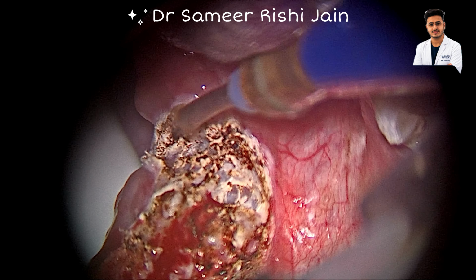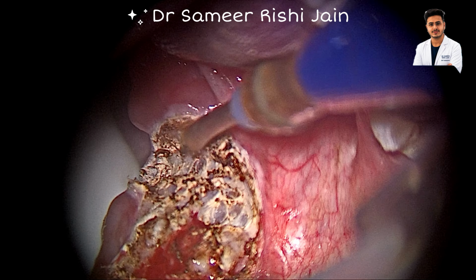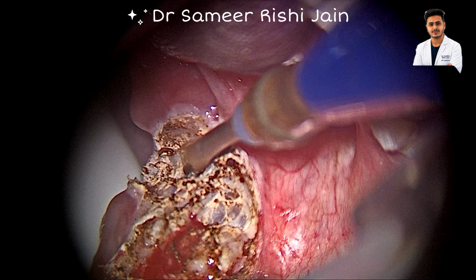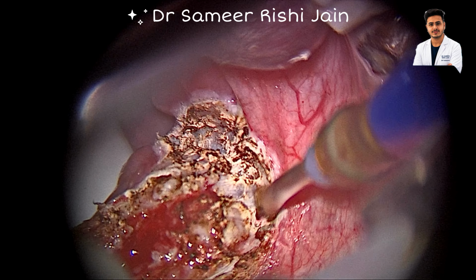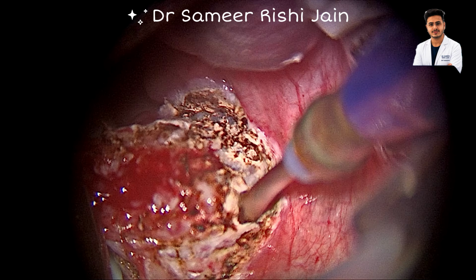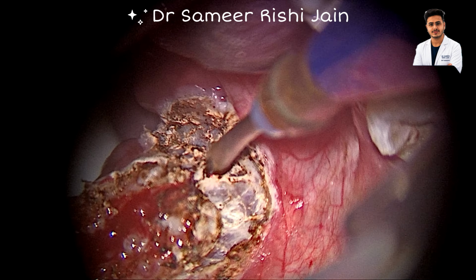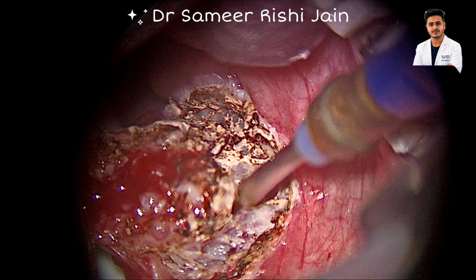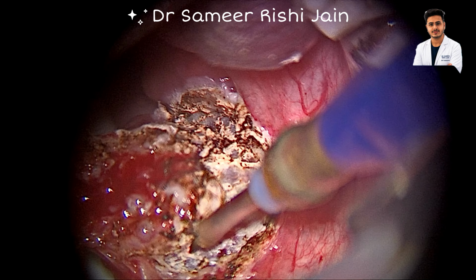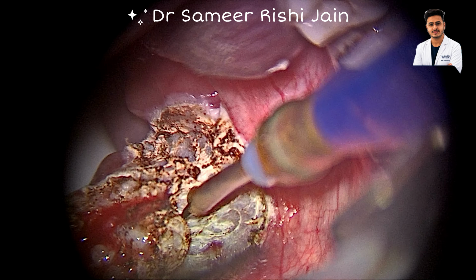Make sure your tissue is a little wet and not absolutely dry, because a little bit of wet tissue helps the cautery to work more properly. So I'm able to see a cotyledon, which is the last cotyledon of the tonsil, and now I'm getting a picture of the fibrous tissue of the tonsillar bed. We have to divide at the level of the junction of the tonsillar tissue and the connective tissue.